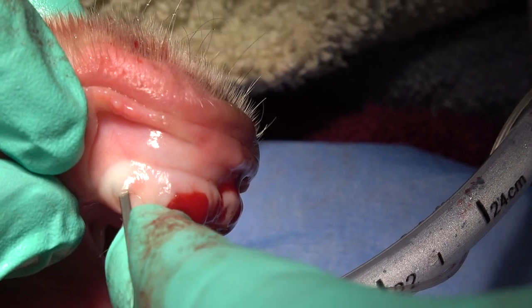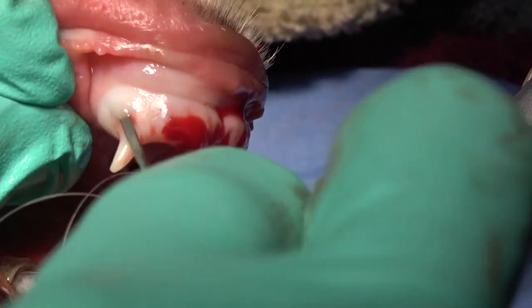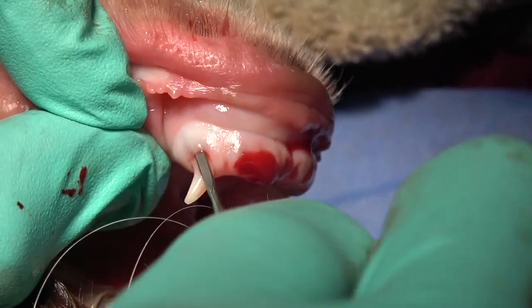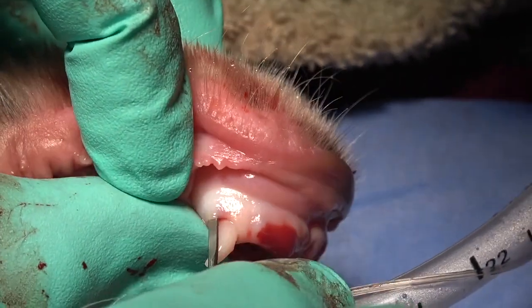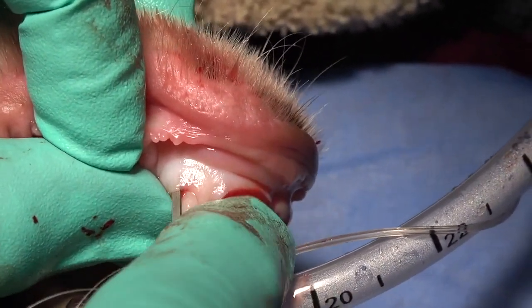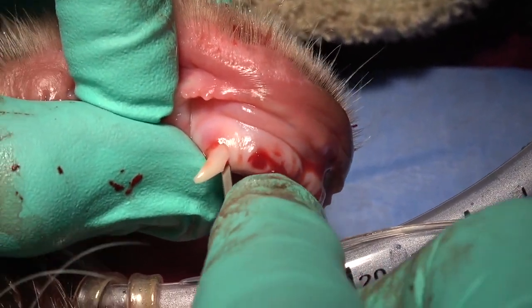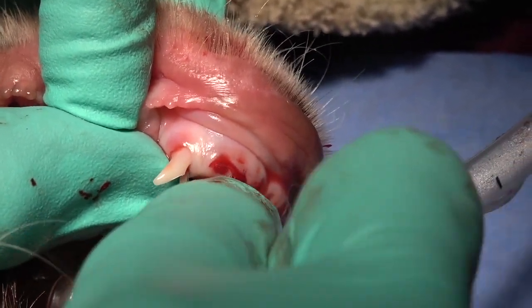The instrumentation we choose for deciduous extractions plays a major role in the time spent on each individual tooth. The periatome is being placed between the bone and the tooth root, just following the normal tooth root contour, and that creates a space that will help with our mesial and distal elevation. The same thing is done on the lingual side, placing it between the tooth and the bone, following the contour of the root.